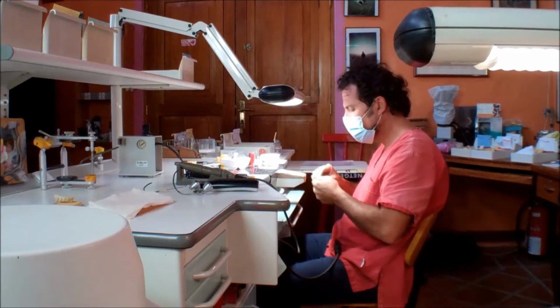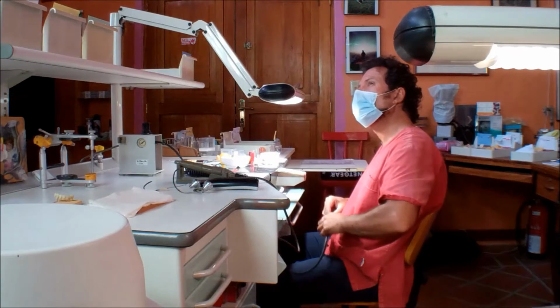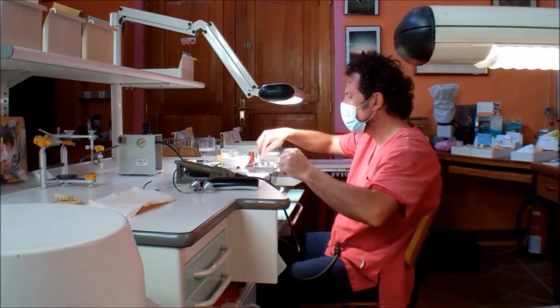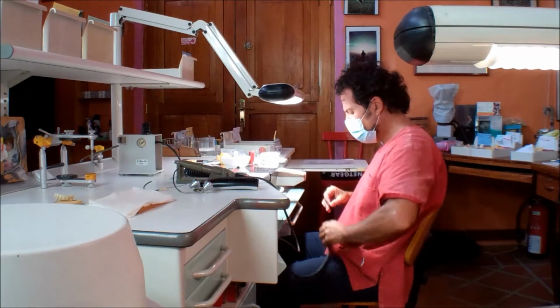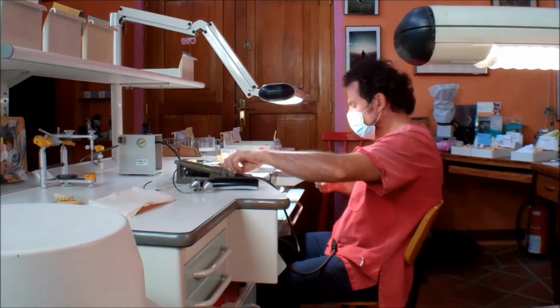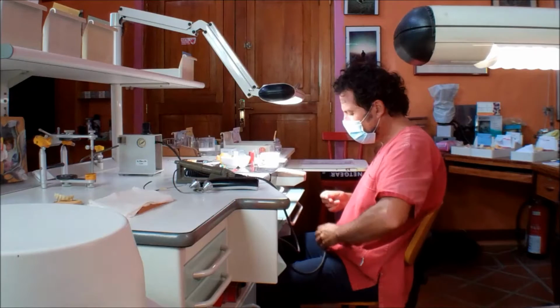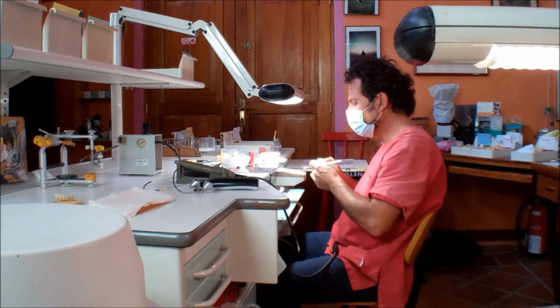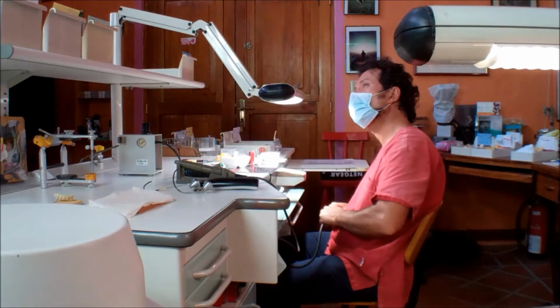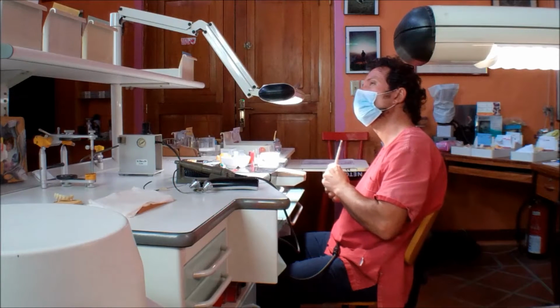Okay. So it's a porcelain that goes over the zirconia? I see. And this is even a very special porcelain. Very special porcelain? Yeah, it's a very nice one. It's a friend of mine that does this in Italy. And for me, one of the best porcelains, very aesthetic. Now, I know for regular PFZ, regular porcelain fused zirconia, I heard that sometimes there could be delamination where the porcelain separates from the zirconia.